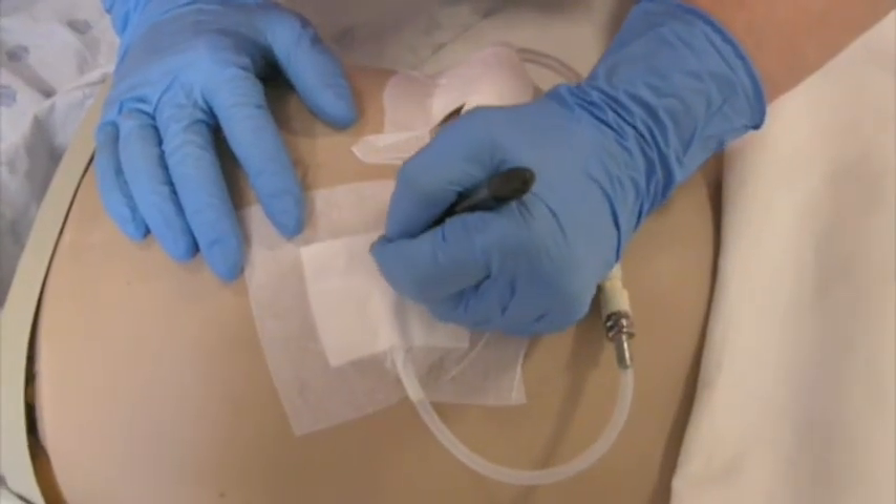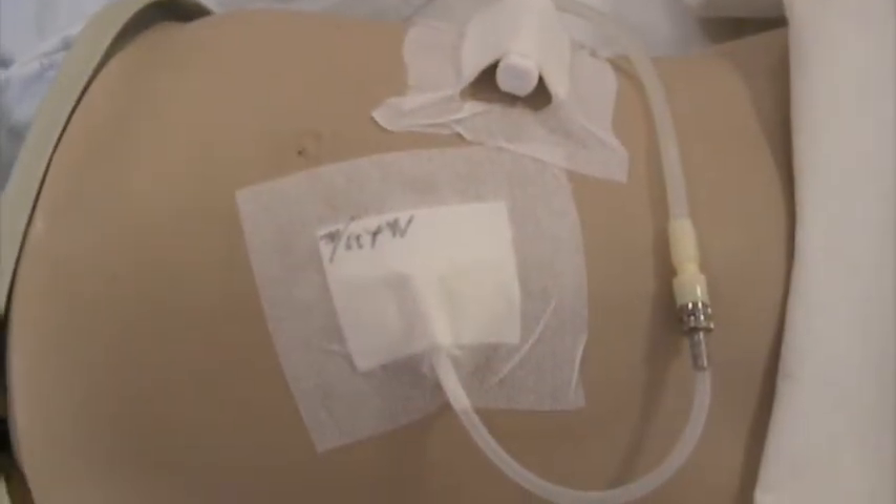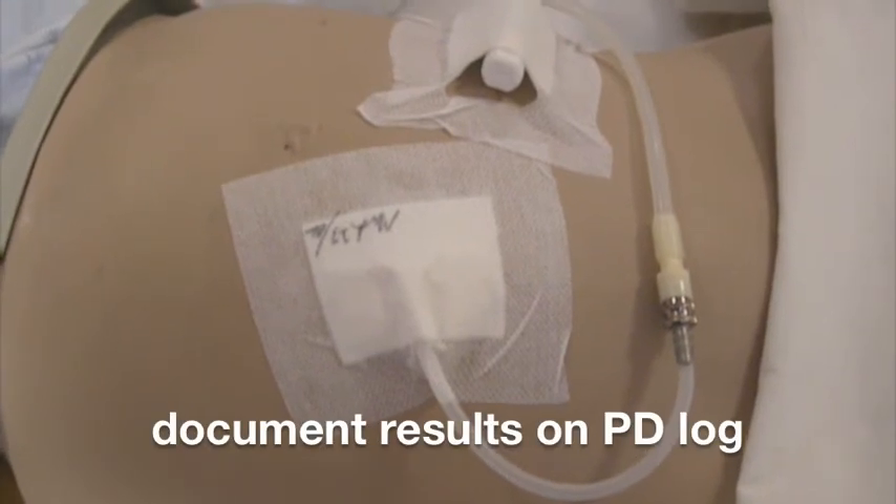Be sure to date your dressing and document your results on the PD log.